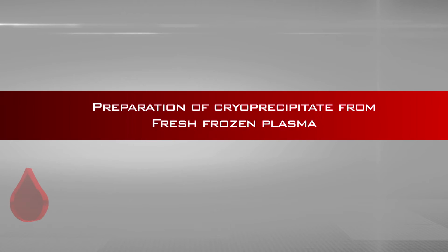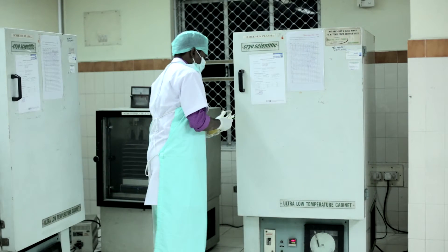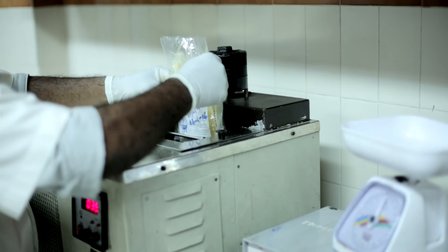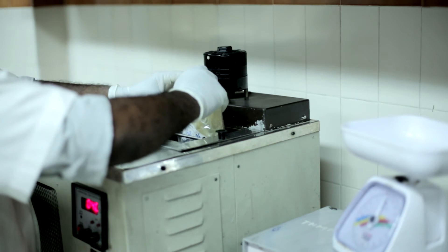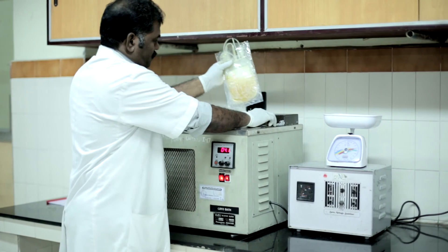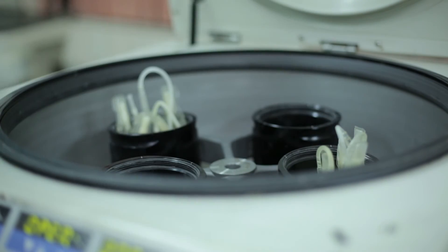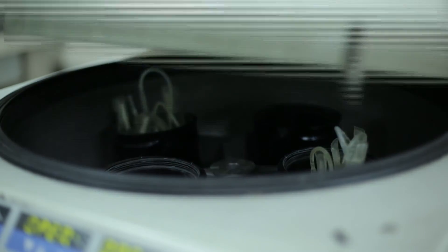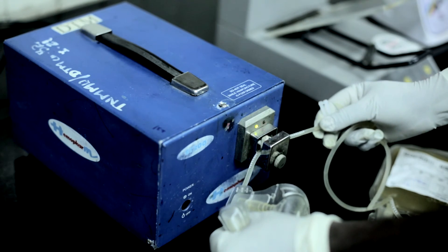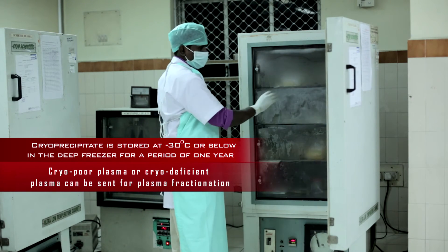Preparation of cryoprecipitate from fresh frozen plasma: Remove the fresh frozen plasma bag from the deep freezer and place it inside a plastic wrapper. Suspend the bag with wrapper at 4 degrees centigrade in a circulating water bath. Within 15 to 30 minutes the plasma becomes slushy. Centrifuge the bag with plasma at 4 degrees centigrade with speed and duration as per manufacturer's instruction. Supernatant cryo-poor plasma is siphoned out, the tubing is sealed, and the bags are separated. Cryoprecipitate is stored at minus 30 degrees centigrade or below in the deep freezer for a period of one year.